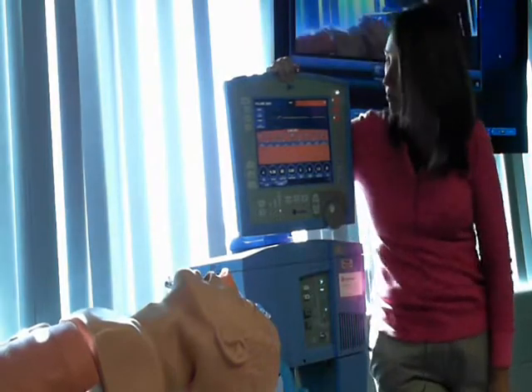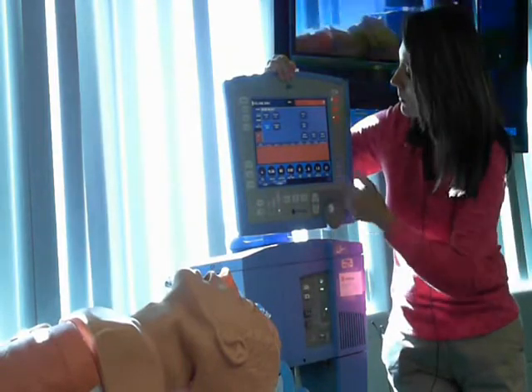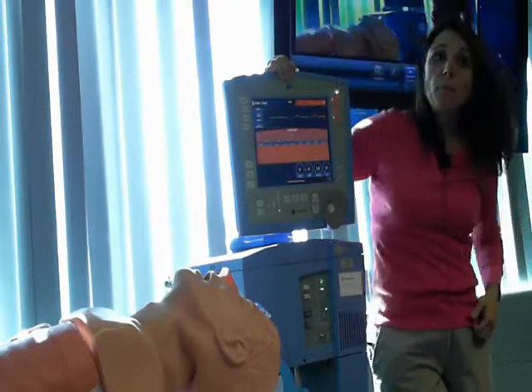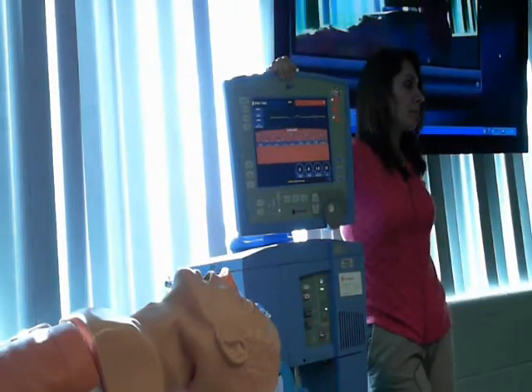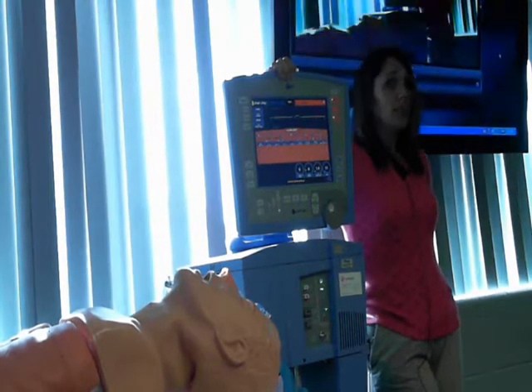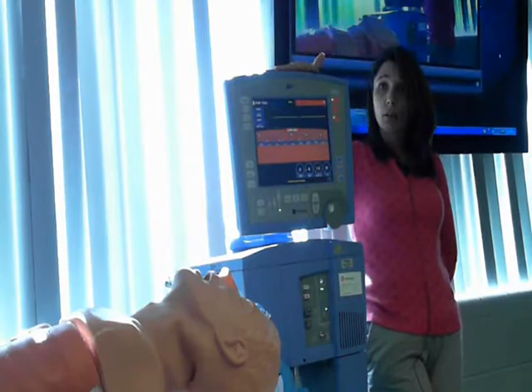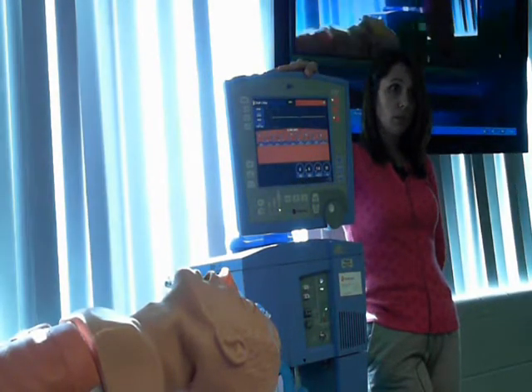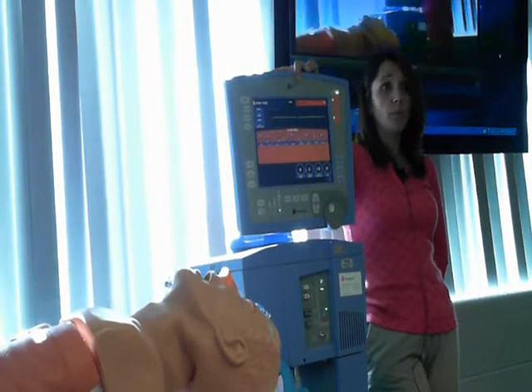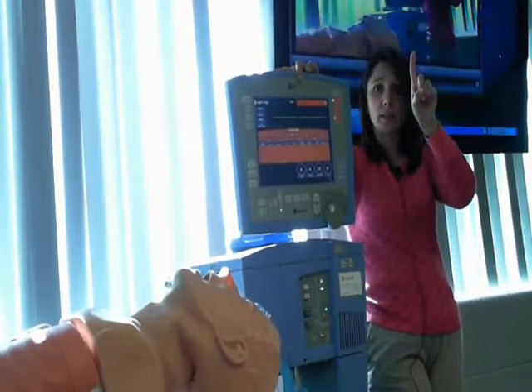Okay, very good. So the next mode I want to talk to you about is something called CPAP. Have you guys heard of CPAP before? Okay, you can do non-invasive CPAP through a mask, or we can do CPAP as a mode via mechanical ventilation. CPAP is a completely spontaneously breathing mode. That means this machine is only giving one pressure continuously.